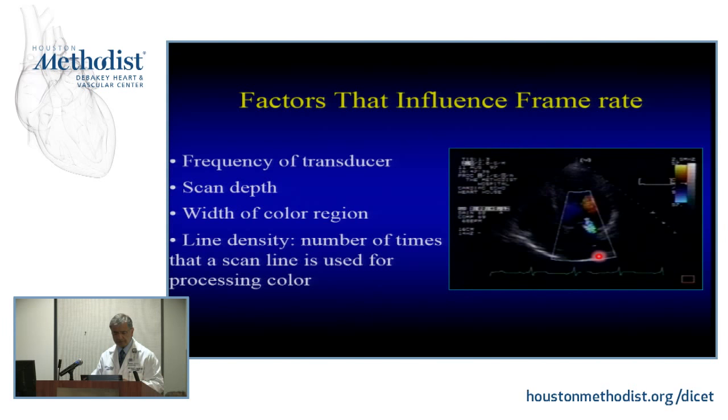I think that's important. Frame rate is crucial because, as we talked about, by 2D imaging you can get to the hundreds of frames per second. Color is always, and 3D is always very important. Your frame rate is really your major limiting step. So further depth is going to make you wait longer and longer to analyze all this data. It's going to slow down. Width of the sector, right? It's going to take much more time to process all this. So you have to remember those.